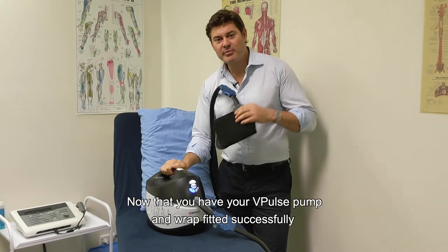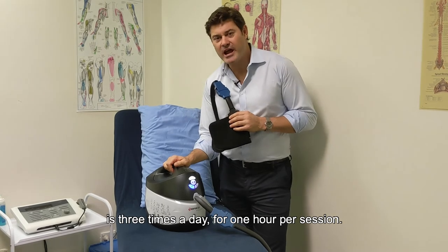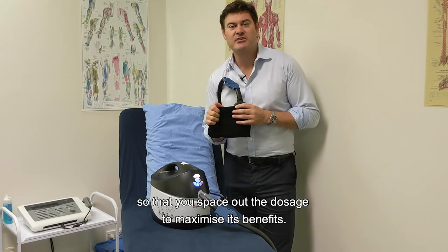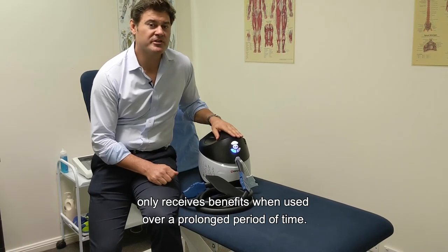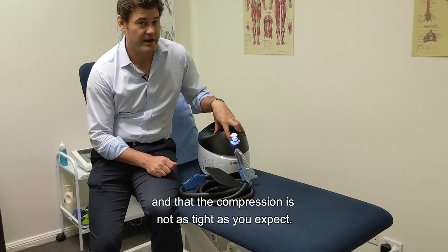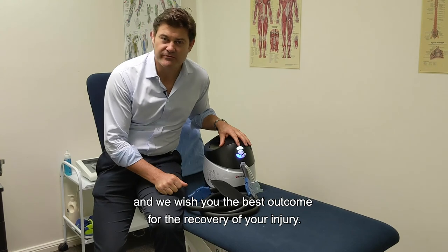Now that your V-Pulse pump and wrap are fitted successfully, the recommended usage in the first six weeks following injury is three times a day for one hour per session — morning, lunch, and afternoon — to space out the dosage and maximize benefits. It's important to note that both temperature and compression only deliver full benefits over a prolonged period of time, so the temperature may not feel as cold and the compression may not feel as tight as expected. This is intentional, to allow the extended duration to provide the best outcome. We hope you enjoyed this demonstration and wish you the best recovery.